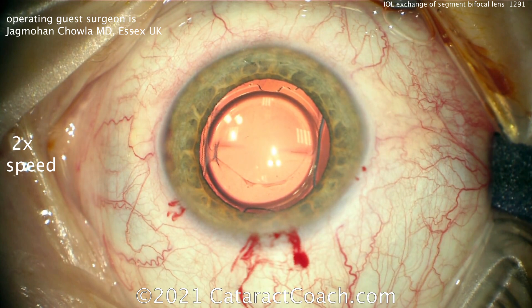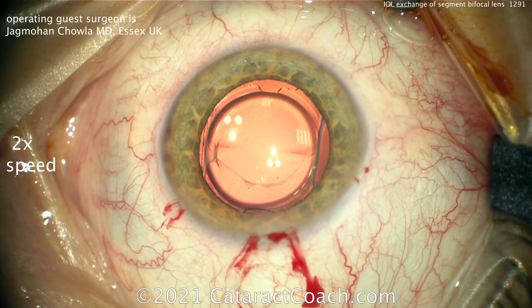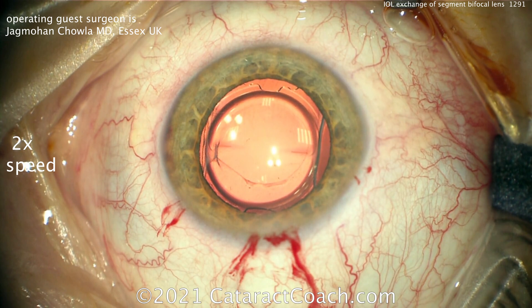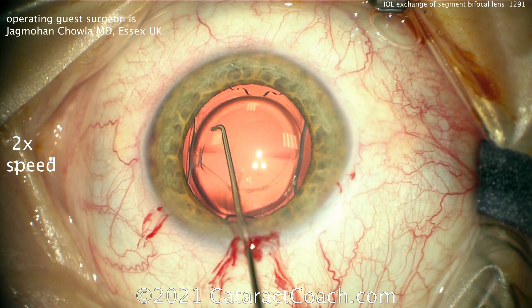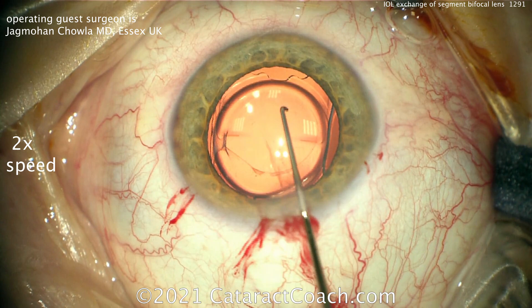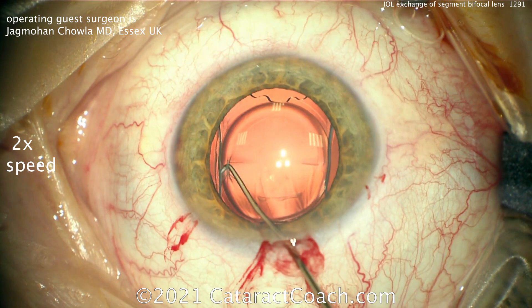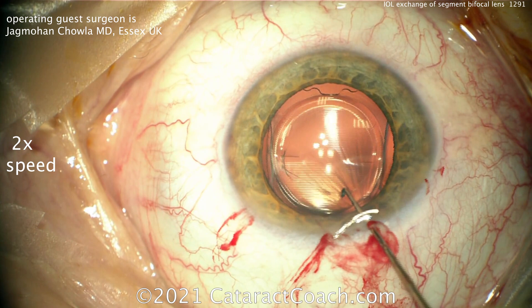Not a difficult thing to perform. In this case, Dr. Chawla is going to do an IOL exchange for an acrylic monofocal lens in the bag, again aiming for plano. He's going to inject the new lens in the capsular bag while the old lens is up in the AC, then bisect the old lens and take it out in pieces. The key here is to get under that rhexis edge using a Sinsky hook to create a little space — that helps separate the IOL from the capsular bag. Make a couple of paracentesis points and go all around.